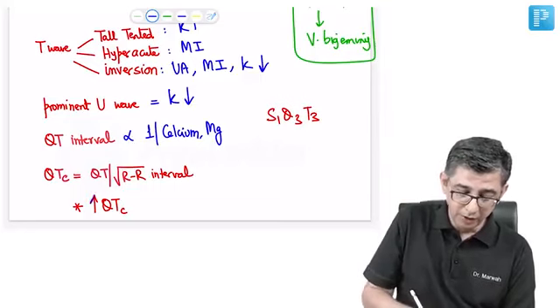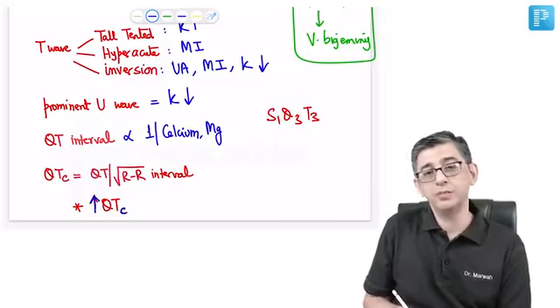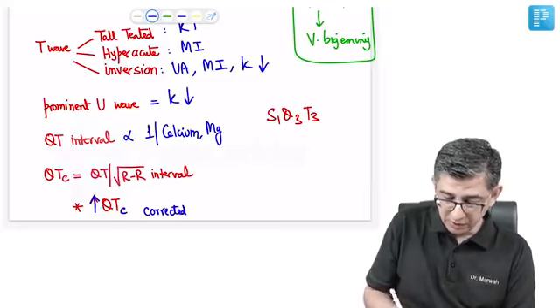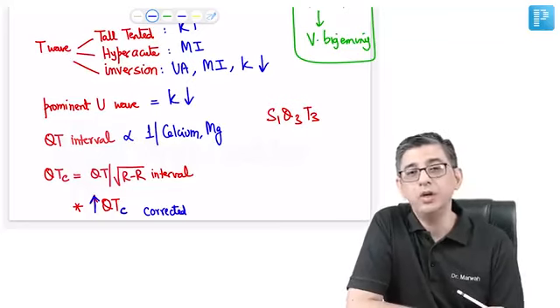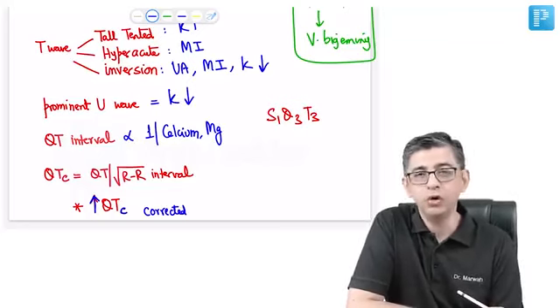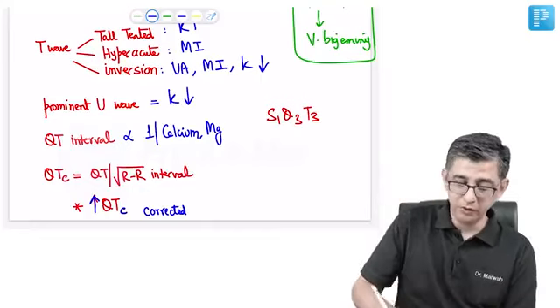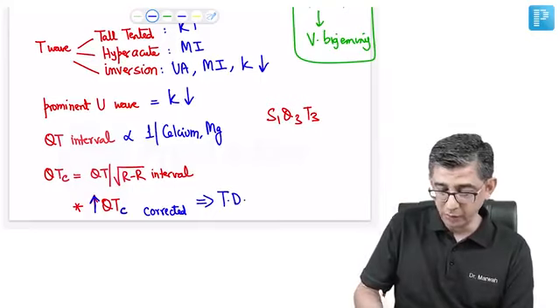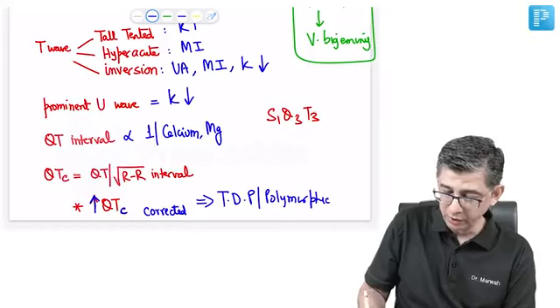but that QT prolongation is important because lots of time there might be written as QT prolongation, but below the word QT there might be a small subscript C. Well, this small subscript C stands for corrected. Let's understand what this QTc means in contrast to plain QT. This QTc means QT divided by root of the RR interval. I mean, this is a mathematical formula which can be asked by itself. What is QTc? It's QTc with the C alphabet stands for corrected. And this is one of the diagnostic criteria for polymorphic ventricular tachycardia, which was also known as Torsades de Pointes.